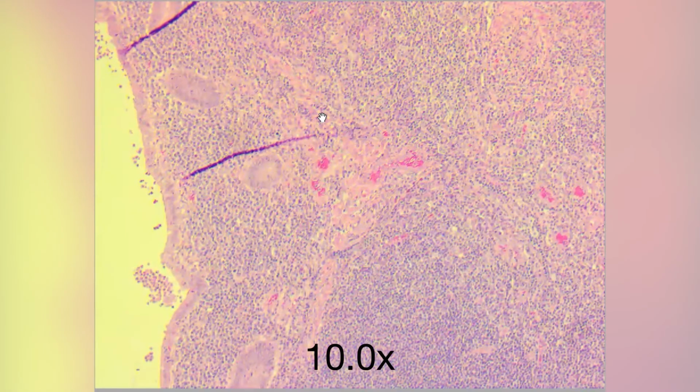Let's go at a higher power and continue at 10x, and I will go through the layers again. So this is the mucosa, this is the muscularis mucosa, and here it's more clear that it's all infiltrated by inflammatory cells. Here we have the submucosa, it's all filled with inflammatory cells, and I will go deeper. So this is the muscularis propria. This is the one we will go at high power to confirm the presence of neutrophils, and at this stage it will be acute appendicitis. And this is the serosal layer.